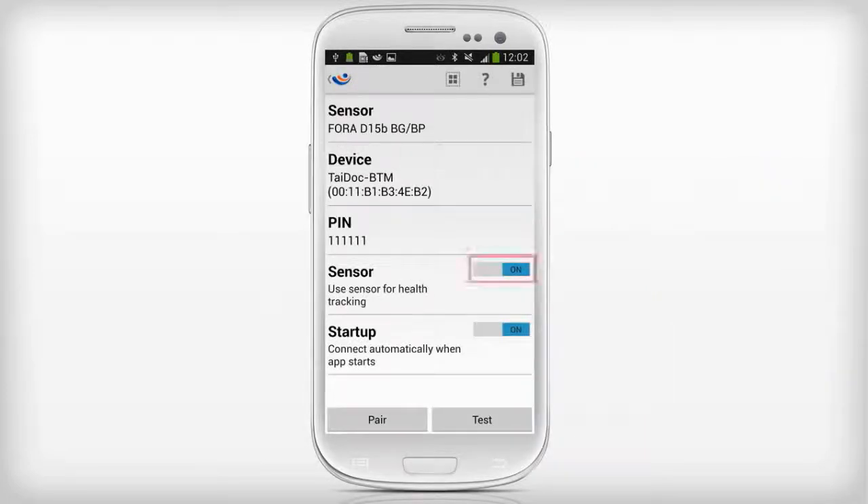Set the Sensor switch to ON to use the sensor in MyFitness Companion. Set the Startup switch to ON if you want MyFitness Companion to connect automatically to the device.